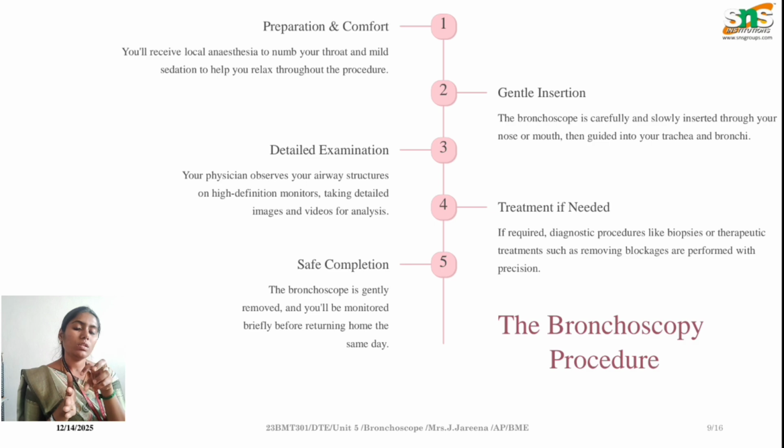Once all the process is done, the bronchoscope has to be removed safely. Then the patients stay in the hospital for a maximum of 5 to 6 hours, and on the same day we can send them back to their home. So without much hospital stay or post-surgery time, the patients are very free, and they can carry out their daily activities.